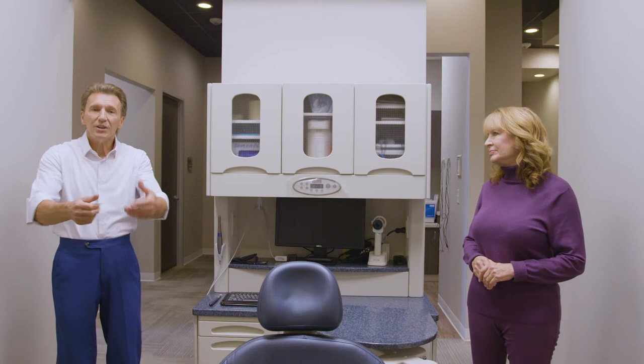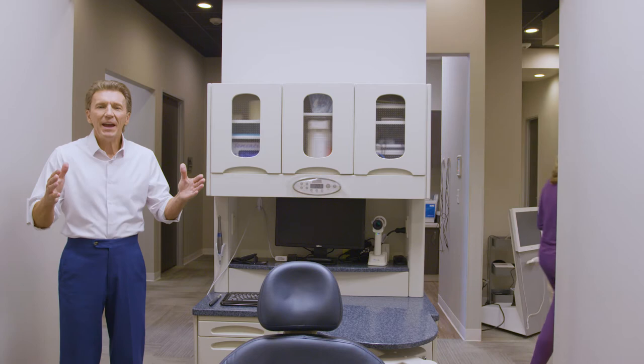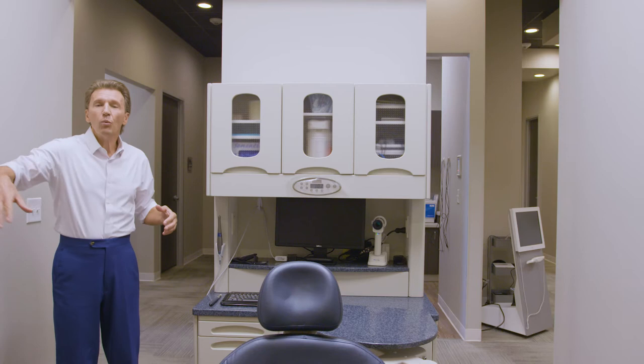My assistant can enter on the left side, and as the assistant, if I need to retrieve an instrument during a procedure, it's very easy for me to get up and leave the room. If that opening is not there, the assistant would be forced to come in this way and walk all the way around the foot end of the dental chair to reach the assistant position.